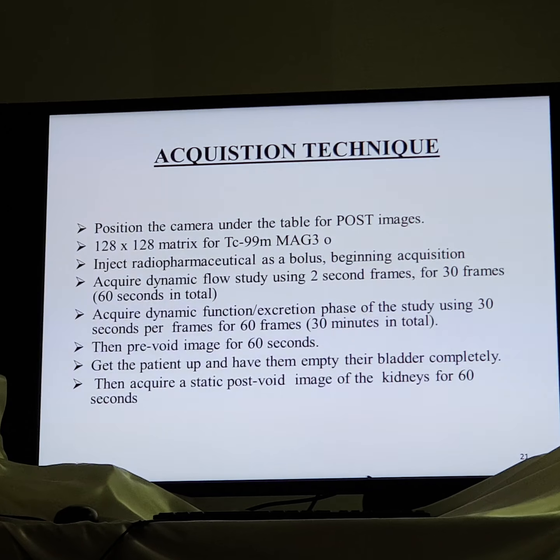And actually it depends. Some books say less, 15 seconds or whatever per frame, and even the total time is different from book to book, but this is the main one and mostly used here in Saudi Arabia. So we scan them 30 seconds per frame for 60 frames. The total will be 30 minutes.